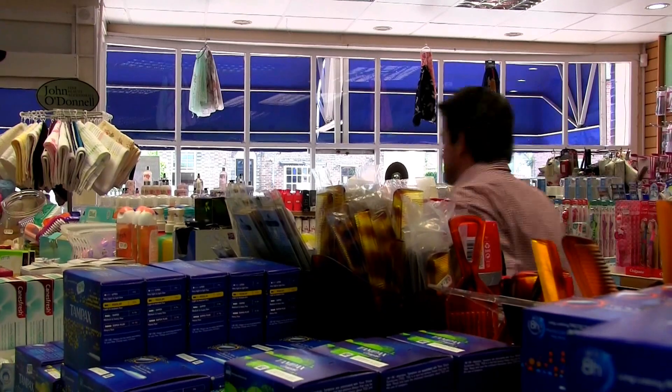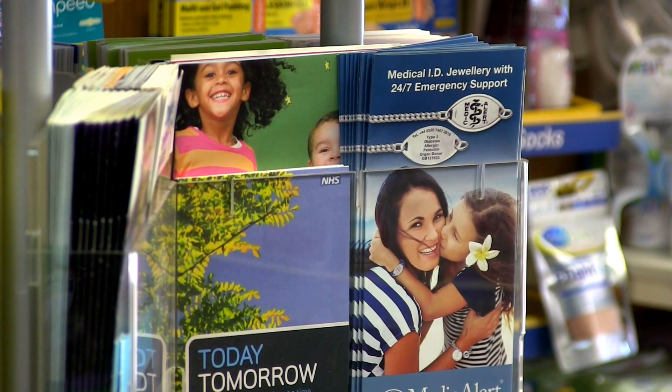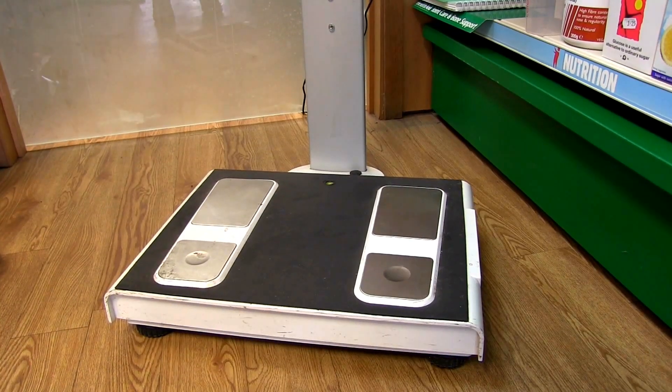Hello, I'm Paul McCaig from the Marsden Group, and I'm here at Selbis Pharmacy in Linfield, Sussex to demonstrate the Marsden MBF 6010 Body Composition Scale. This is a 300 kilo capacity body composition scale with a 100 gram division size and is ideal for pharmacy use.